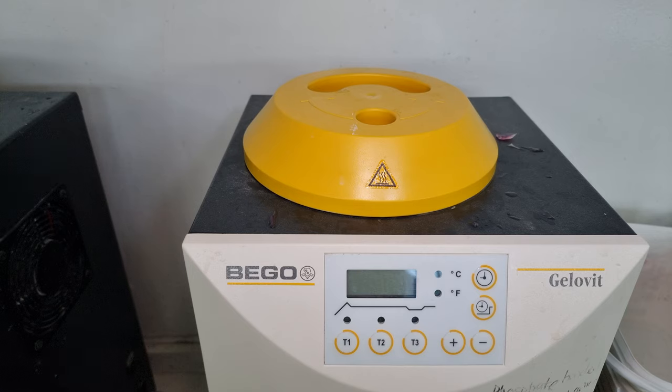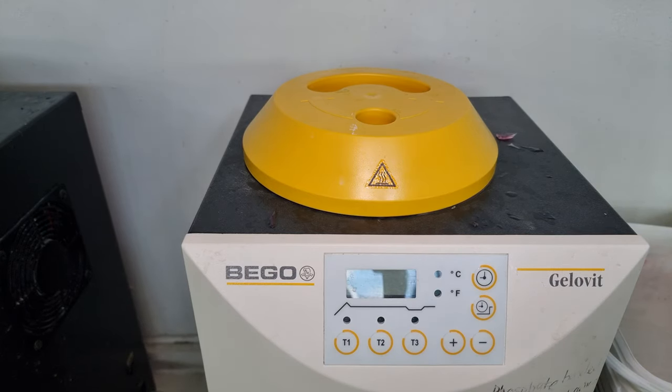In this lab, we are using two types of gel. That is for the application of chrome cobalt refractory cast, especially for phosphate bonded investment, and another one is gypsum duplication work. If you want to use this gel, make sure you use the right one. If not, it will not work, with multiple issues.